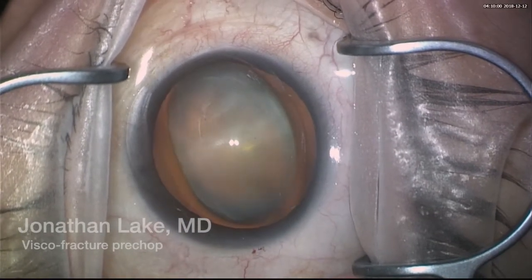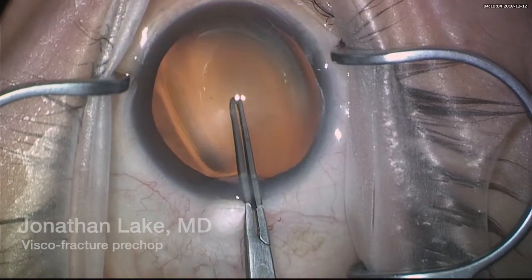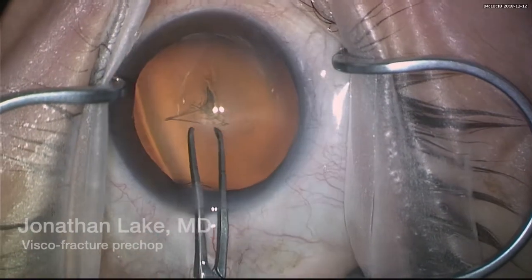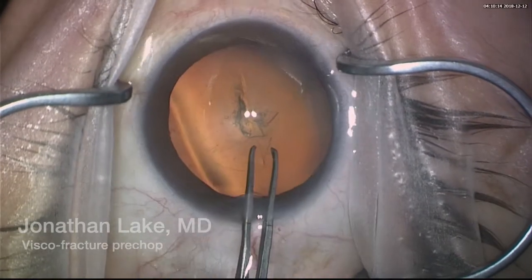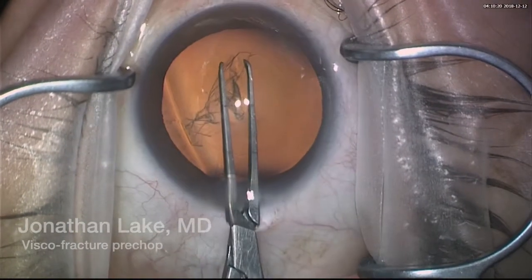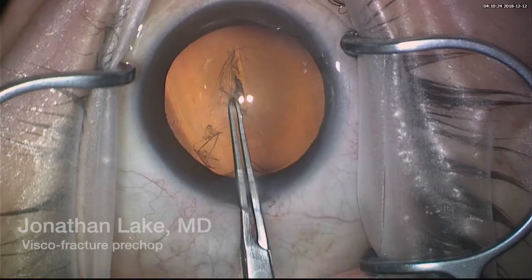We'll start here with a rhexis. I'm using a direct cross capsule rhexis from Duckworth and Kent — no financial interest here, but it's a great little device. We have a very good red reflex and very good dilation, so the capsule rhexis is pretty uneventful.